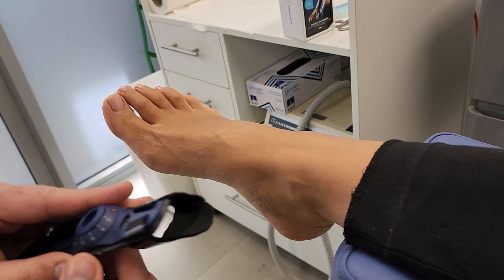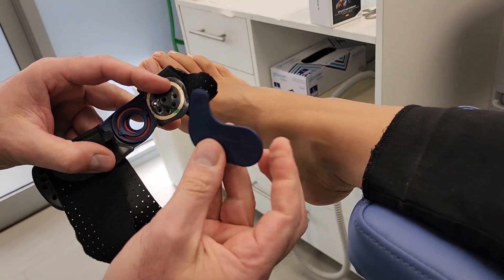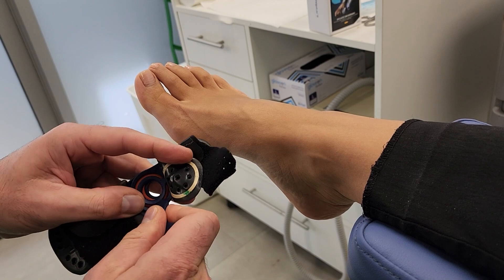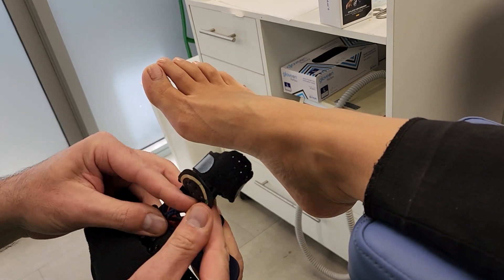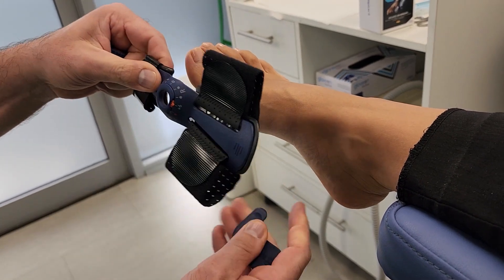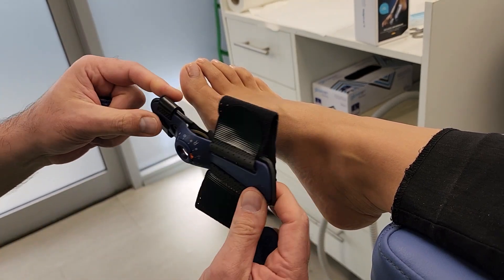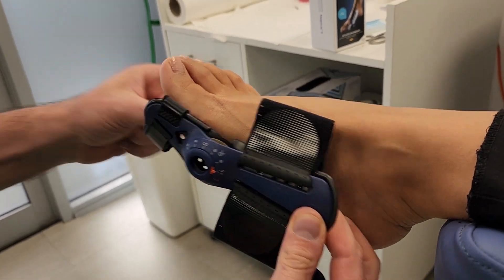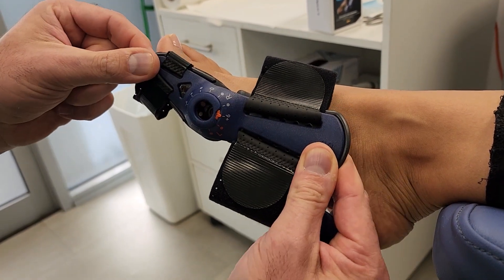So if you really want to structure it: there's this little clip here, and they give you this small tool to pop it open. It is universal in that it will fit on the right or the left foot. And then you can change the degrees — wherever you want the joint angled, you can position this accordingly.